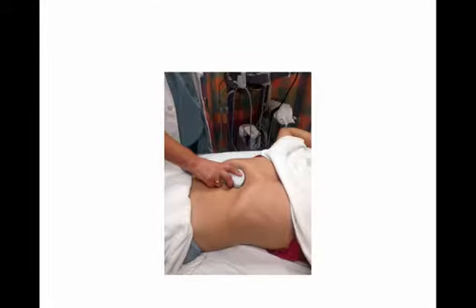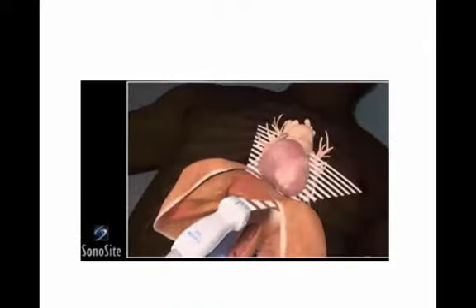Let's move on to the pertinent orientations for this study. All of our patients are in the supine position, as in this picture here. Our aim is to generate a coronal view of the heart using a subxiphoid view or approach. Now, the most difficult part you learners have with this particular view is understanding the spatial orientation of the probe beam in relation to the anatomic structures and how that image is displayed on the ultrasound screen.